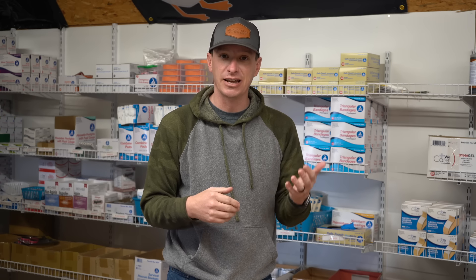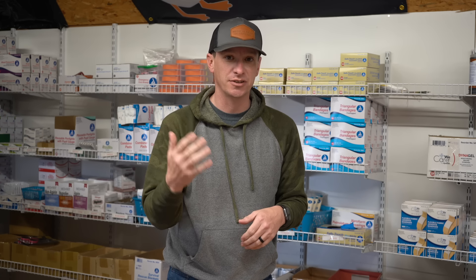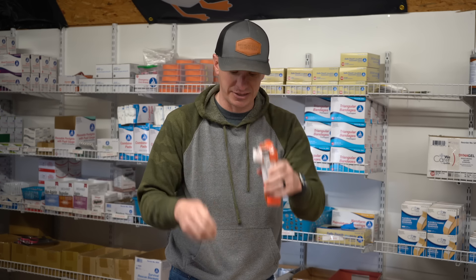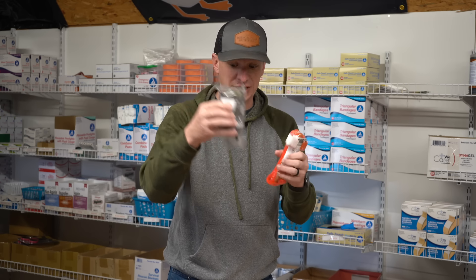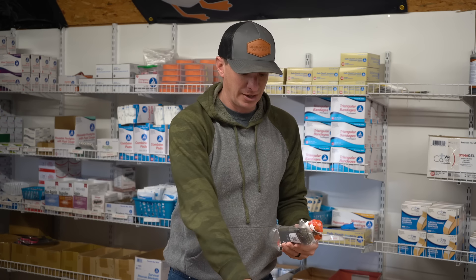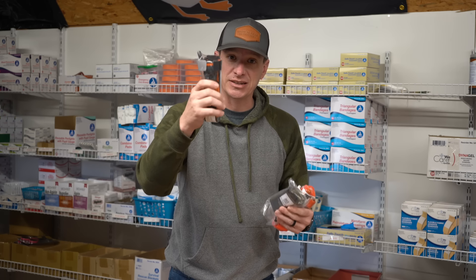If you like the CAT, stick with the CAT. If you like the SOFT-T, stick with the SOFT-T. For me, my kits will have maybe two CATs in there. You could put two SOFT-Ts, the new Everyday Tourniquets, or two SAM XTs. All are solid choices.